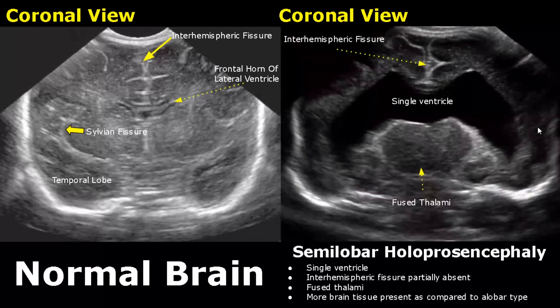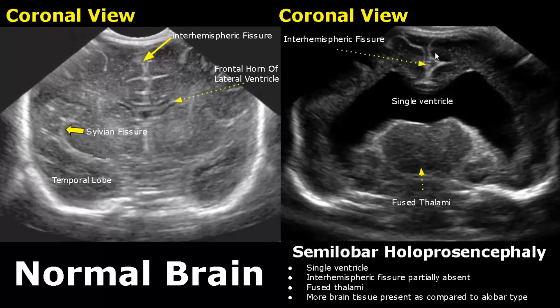Semilobar holoprosencephaly is less severe than the alobar type. A single ventricle is present and the thalami are also fused, but we do see an interhemispheric fissure — it is not complete but it is still present. More brain tissue is found as compared to the alobar type.